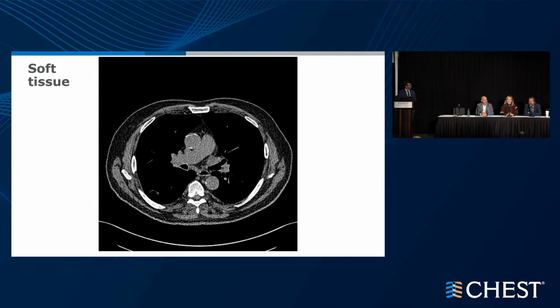I don't know. So I do not routinely get PET scans before just about any of my procedures here because, as Eric Rogan and Stephen Deppen in our group have demonstrated, the specificity of FDG avid nodal disease here is a lot lower than it has been more widely published. And so it rarely influences what I do.